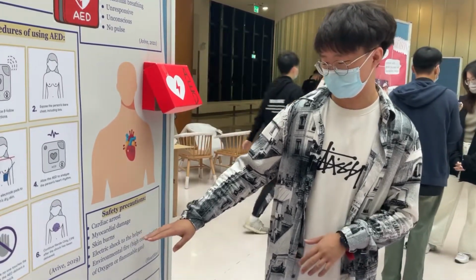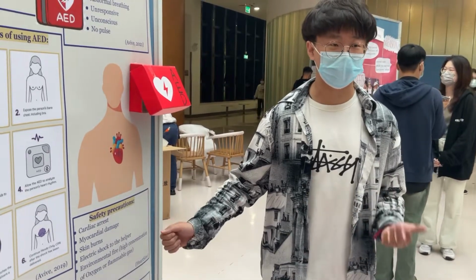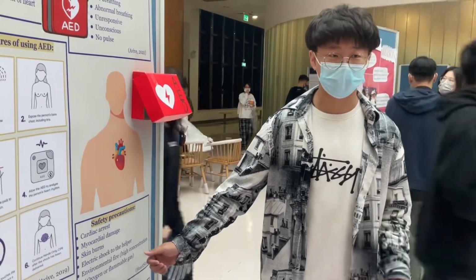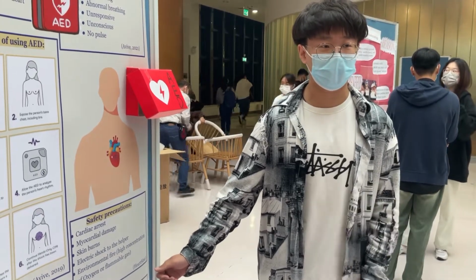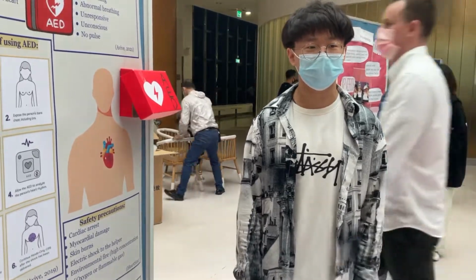And next is electric shock to the helper. Before giving the shock, we need to make sure that no one is touching the patient and everyone is standing by. And for the environmental fire, before giving the shock, we need to make sure that the patient is not in an environment of high oxygen or flammable gas. So the shock given by the AED will not cause a fire.